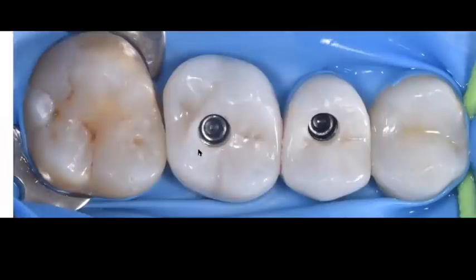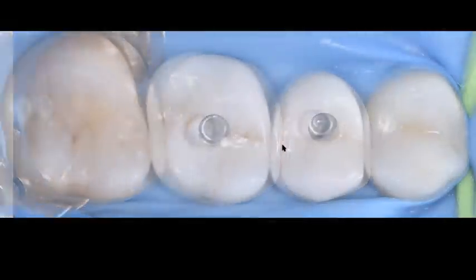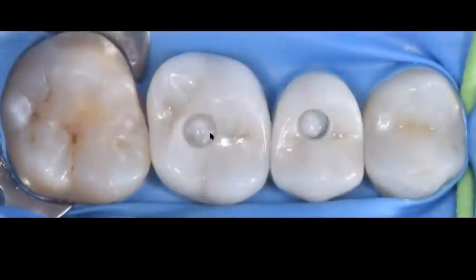So the first thing that we're going to do, once we have isolated this area and I'm ready to restore this, and this is exactly the day of delivery of these restorations, is, as we all know, place our Teflon tape so that we don't have any composite getting into the screw, so that we can remove these restorations if we ever need to, right? So we place these Teflon tapes, and then right on top of this Teflon tape, these are zirconia crowns.